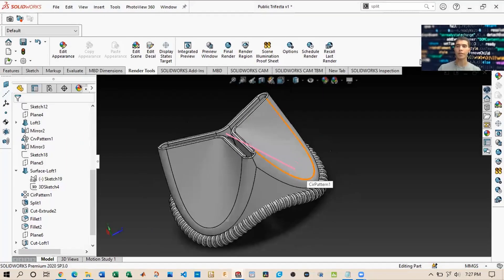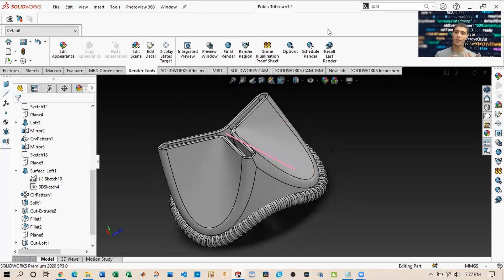That's pretty much it for this session. Some key takeaways include learning how to do splines, how to split bodies, how to create curvature functions — which was a new feature — and how to eventually make this presentable using rendering options.